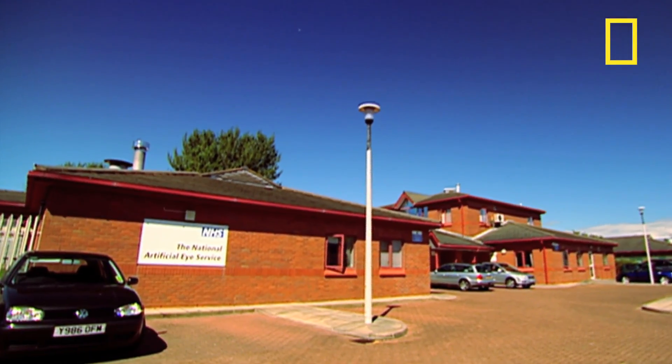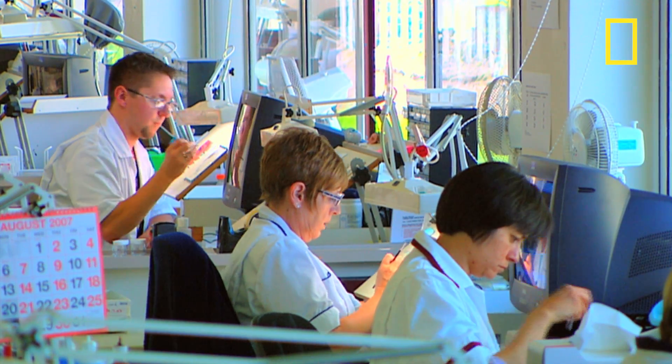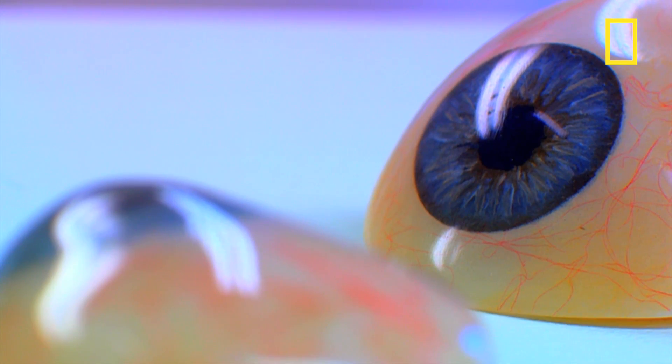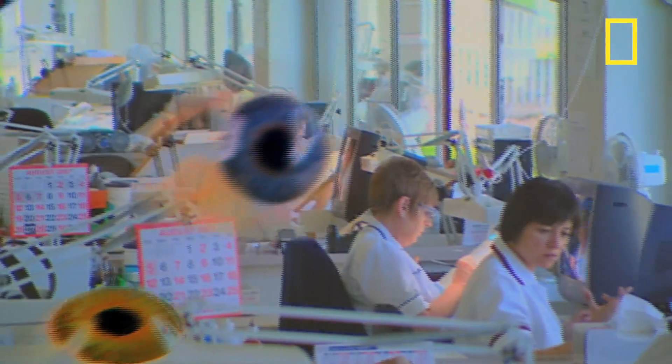This medical laboratory has been producing artificial eyes since World War One. Back then they were known as the army spectacle depot, but they've come a long way since then. Now they look after over 40,000 patients and they make over 6,000 eyes a year.